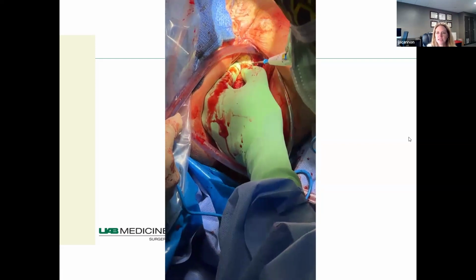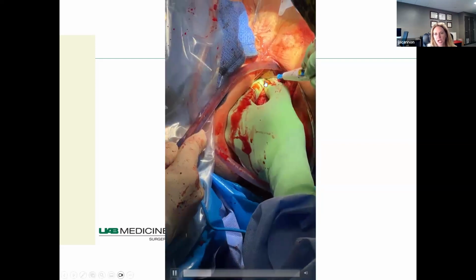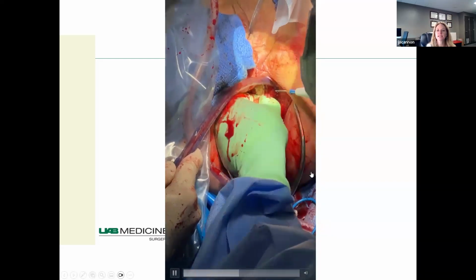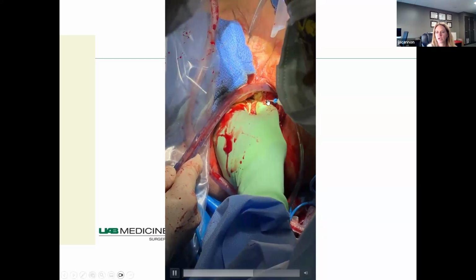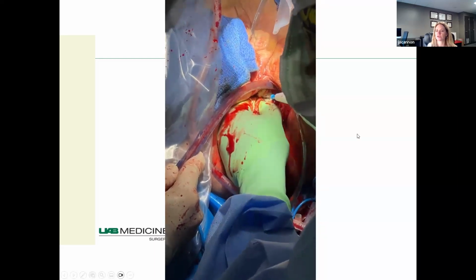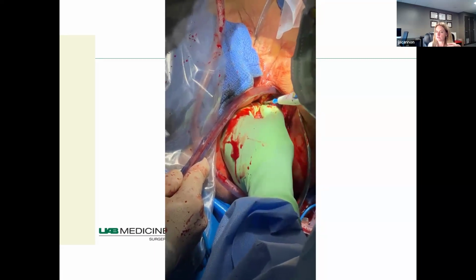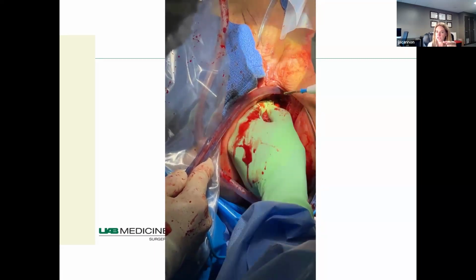And then, so here you see Stevie J taking down the vagina off of the rectum as we continue the anterior dissection. If you can see that plane well, you can continue it just like we are here. And if your anterior dissection was very low, you can often just place a finger like you did with the levators and hook above the vagina where you've dissected it out as she's doing there. And then you can see that plane very nicely. In some patients, it can be difficult to bring that into view, particularly if you haven't done as much from an anterior approach.